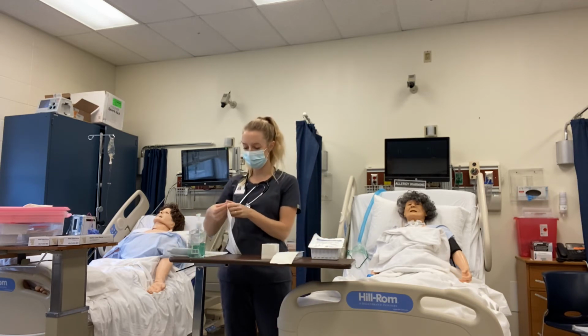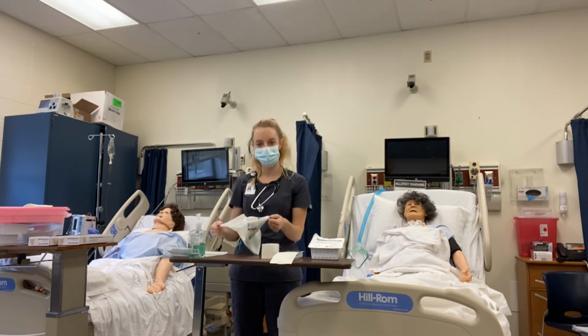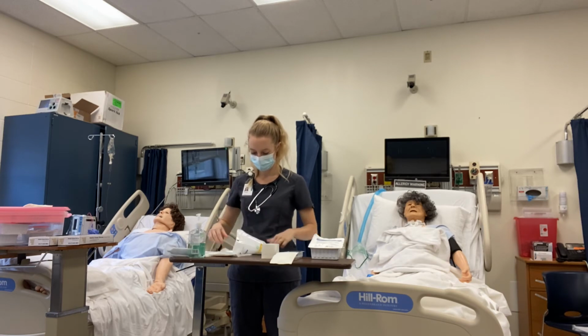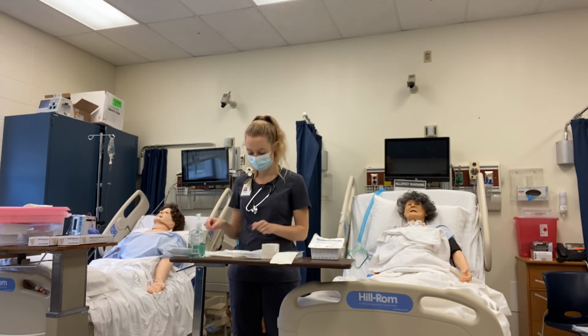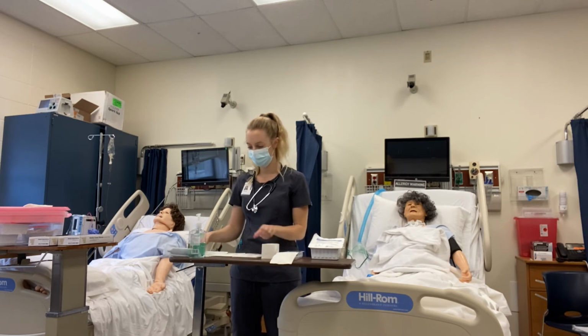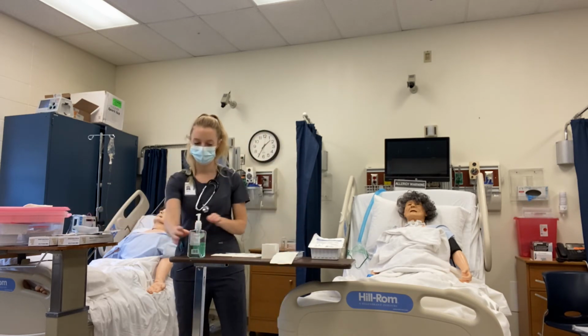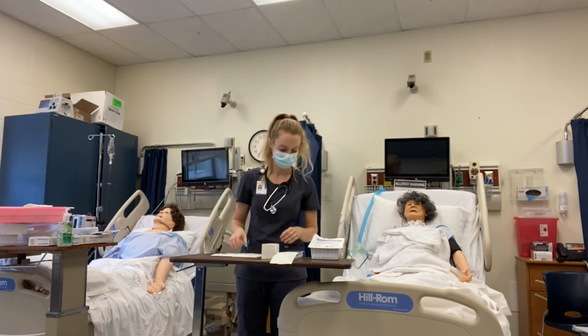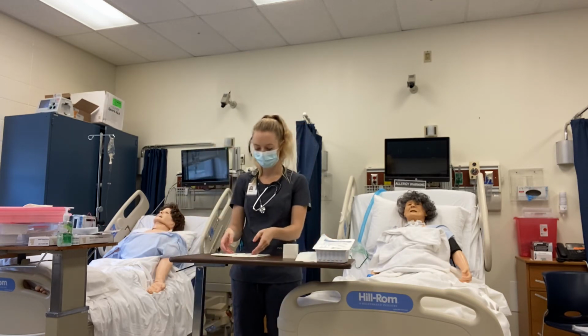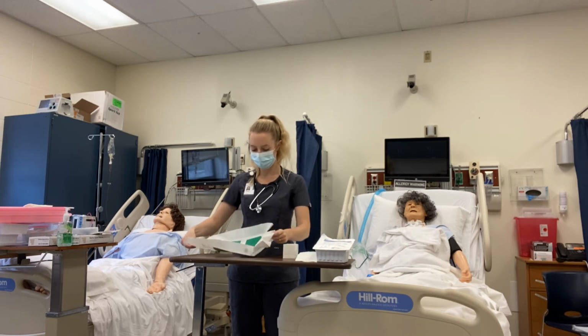Next, I don my sterile gloves after performing hand hygiene. I only want to touch the outer inch.